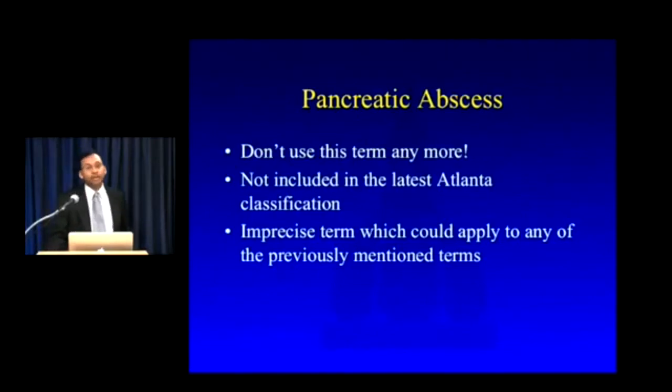Now, don't use the term pancreatic abscess. This is a term that's not included in the revised Atlanta classification. It's imprecise. You can see how it could potentially apply to any of the previously mentioned terms we discussed. This is not a good term to use. I don't use it in my dictations ever.